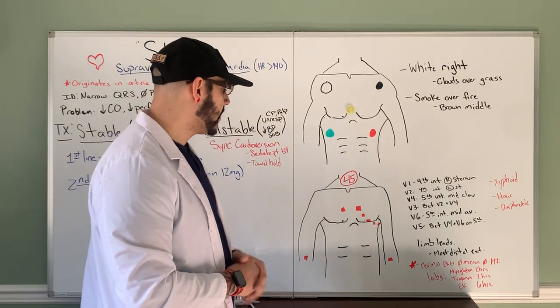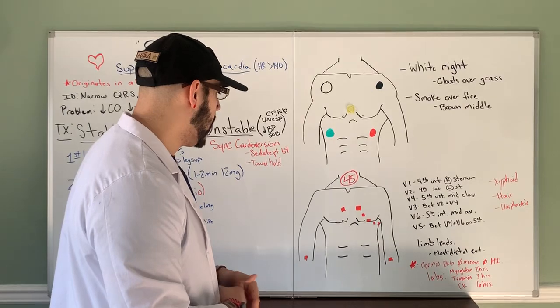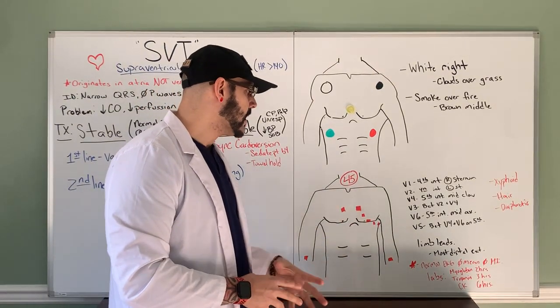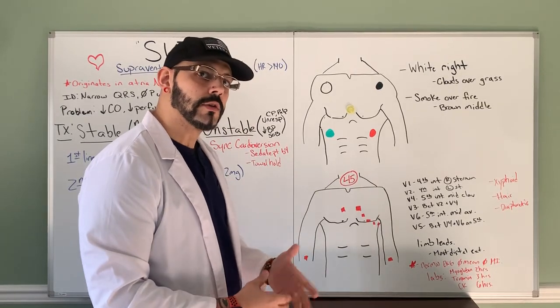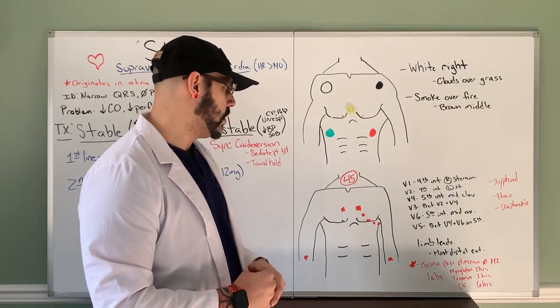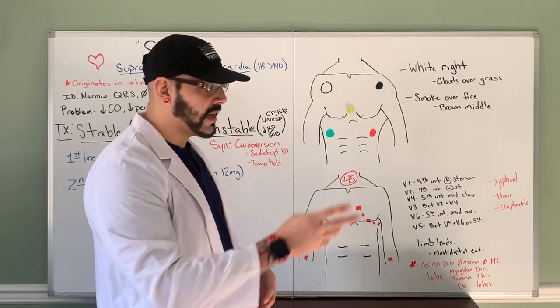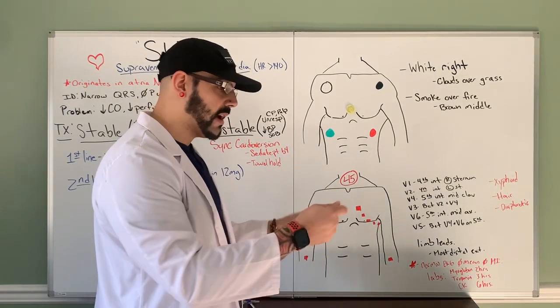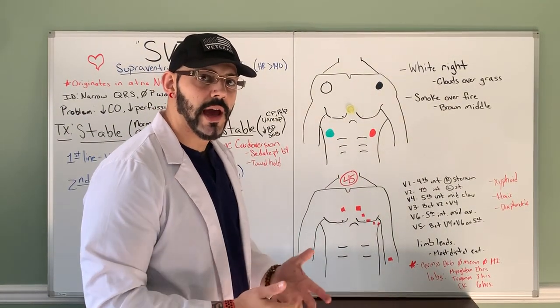This setup over here is for patients that are getting EKG, ECG, all right? This is more commonly fumbled in the field or in the hospitals. Sometimes people are doing this in a rush. They might not put the stickers in the right placement. They're not getting an accurate reading. They've got to fumble with it, go back and forth and play with it to try and make sure that the EKG monitor is reading it accurately, okay?